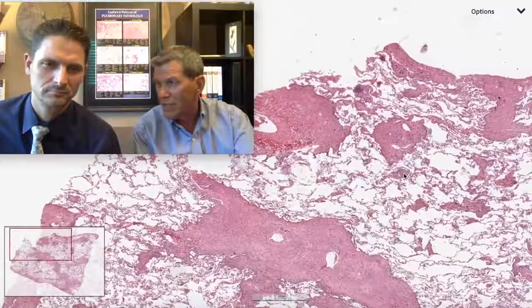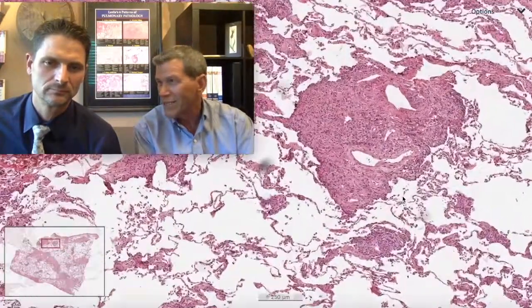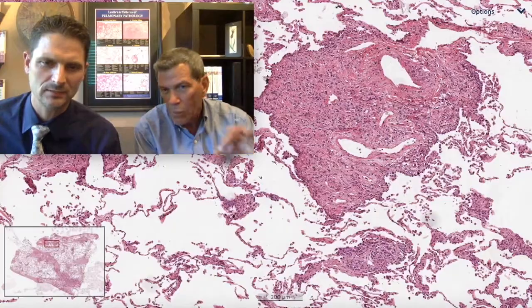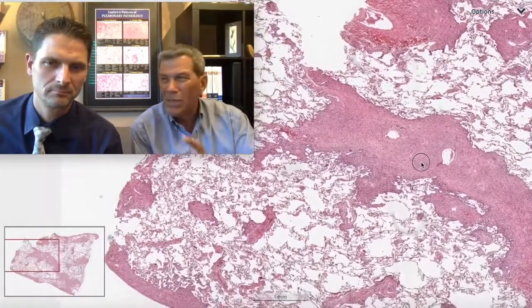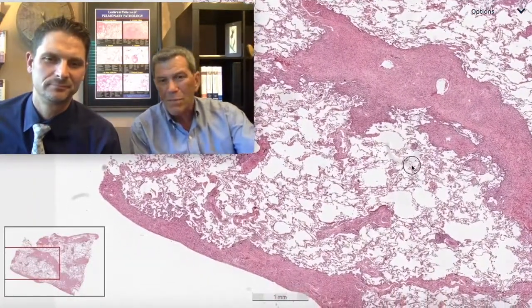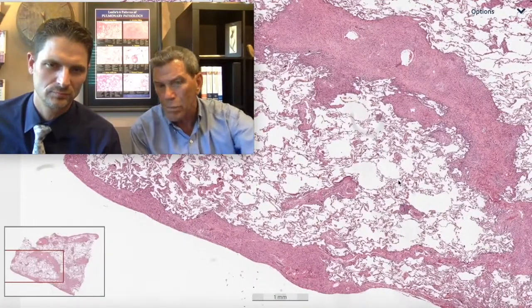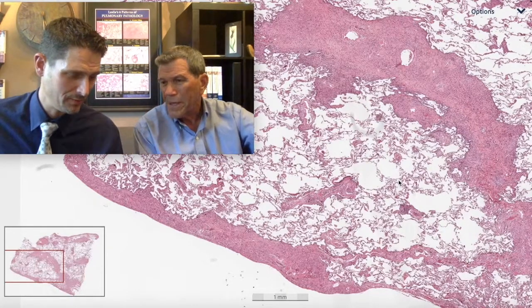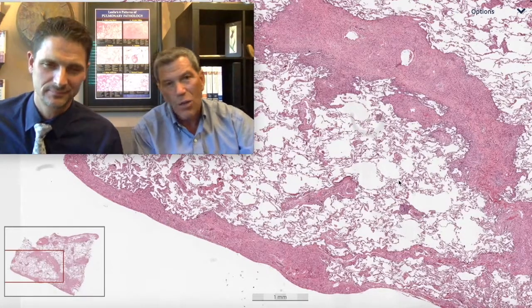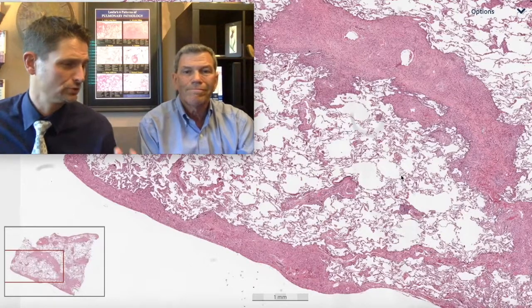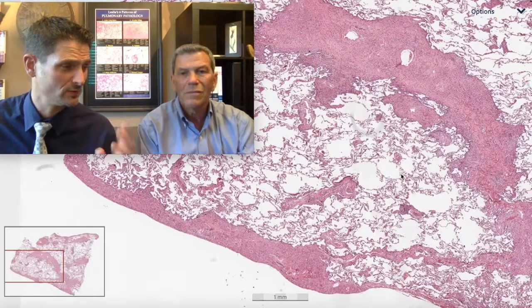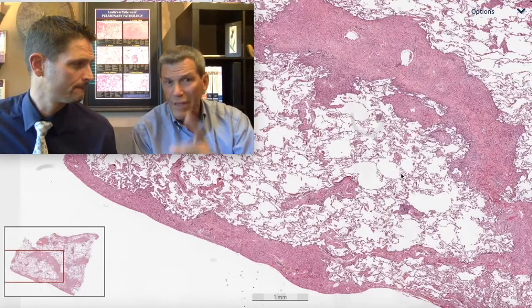Scarring along the airways and also in the pleura brings up a very focused differential. At higher magnification, if I found granulomas in this fibrosis, this would be a great sarcoidosis case or even some rare granulomatous disease. But the distribution to me is perilymphatic, because the lymphatics run along the bronchovascular bundles and also run in the pleura. Diseases that affect the bronchovascular bundles, thicken the pleura, and involve the interlobular septa have a perilymphatic distribution — and everyone should think first of sarcoidosis.